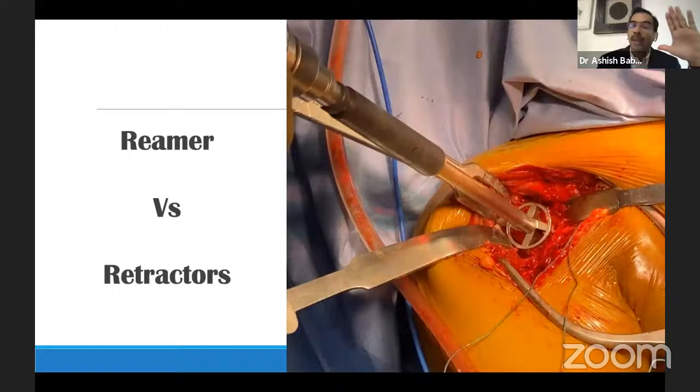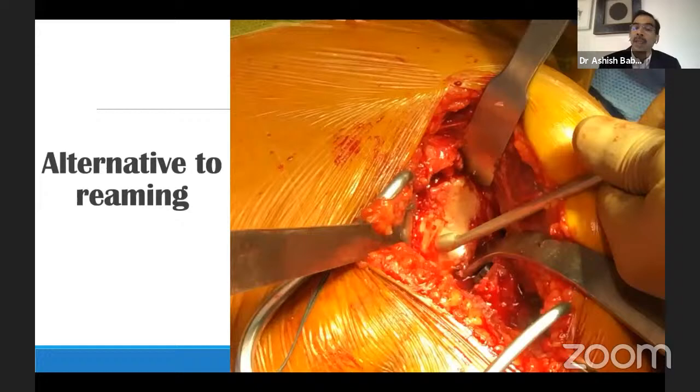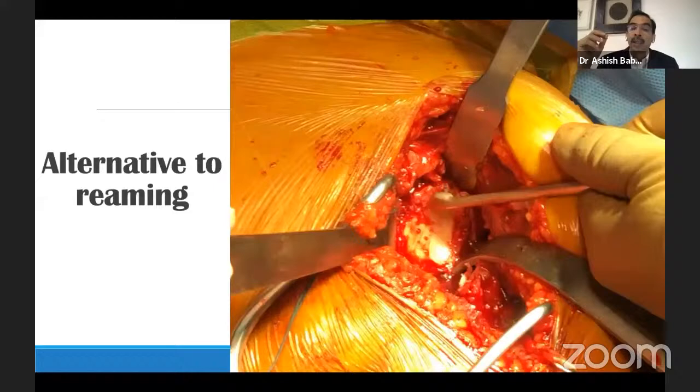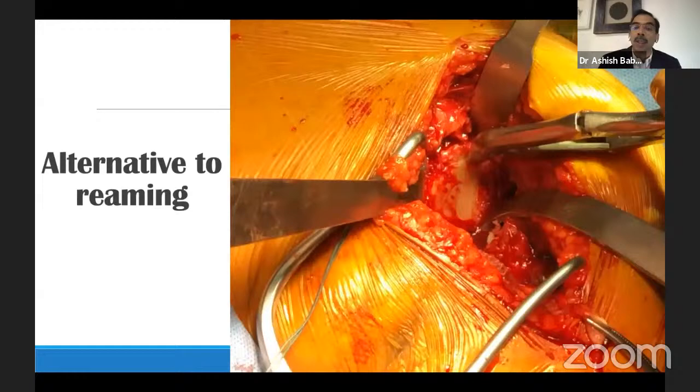I don't do an extensive reaming like the acetabulum. It's barely just a dusting of the glenoid. But here's my take on those frail old grannies. I avoid the reamer and I use a curette because I'm just doing this safely, but you need to do it in a uniform manner. I picked this idea from Mike Wroblewski from Wrightington when I trained under him for hip arthroplasty. And I use this very regularly for those frail ladies who have a very poor quality bone. It's a safe technique to use rather than those powerful reamers when you suspect that.